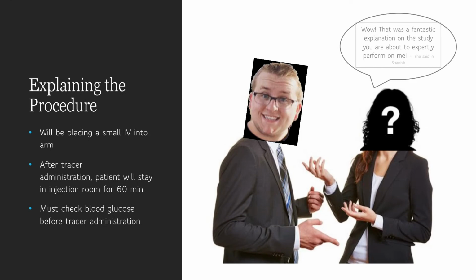After confirming what was on the PET CT questionnaire, I then proceeded to explain the procedure. I explained that her doctor ordered a PET CT scan to evaluate the nodules that were found in her lungs during her previous CT scan. I explained that I will be placing a small IV into her arm and injecting a radiotracer that is essentially radioactive sugar that will allow us to metabolically image the area between her eyes and thighs.